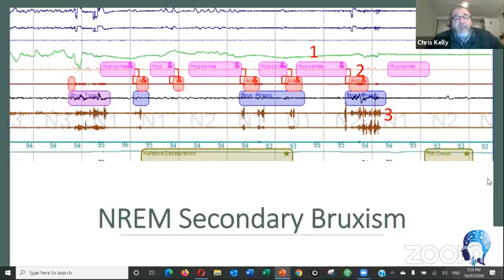But look, right at the top of all of that, you've got number one. As you move from left to right, you see some hypopneas, then you see an orange-red thing. That's an arousal, just marking that because the brain signal is actually missing on this snippet.